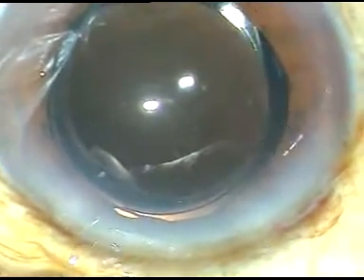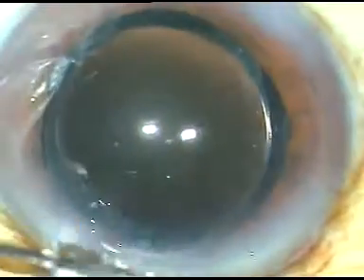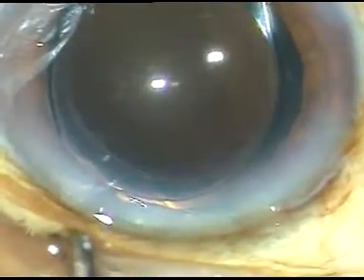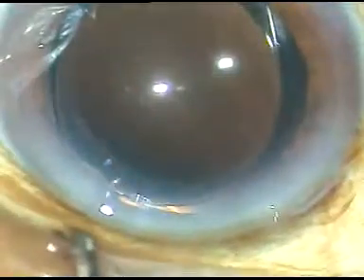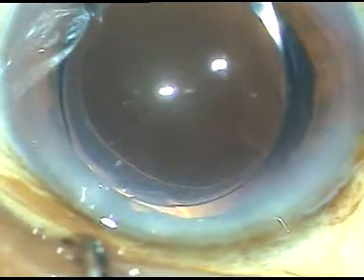And now the side ports are hydrated and these wounds become waterproof. Now this is the final wash. I go to higher magnification and see what happens. Viscoelastic substance which sticks to the corneal endothelium gets dislodged by this irrigation and it comes out. Thus, I ensure 100% removal of viscoelastic substance.